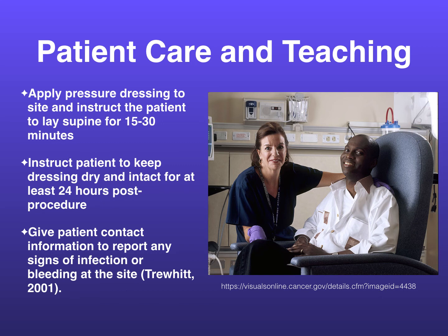Instruct the patient to keep this dressing dry and intact for at least 24 hours post-procedure, and advise them to call if they experience any signs of infection or bleeding. The patient should be contacted 24 hours after the procedure and then again in 1 week to ensure that they are not experiencing any adverse events.